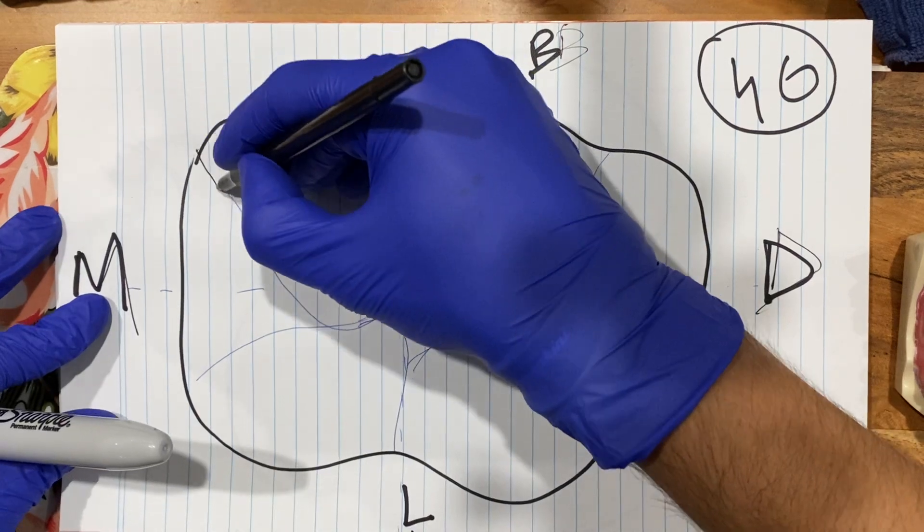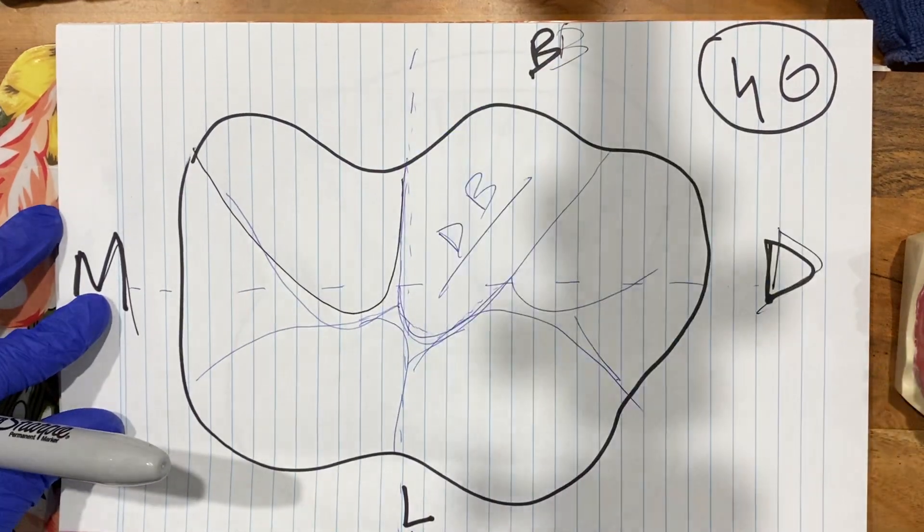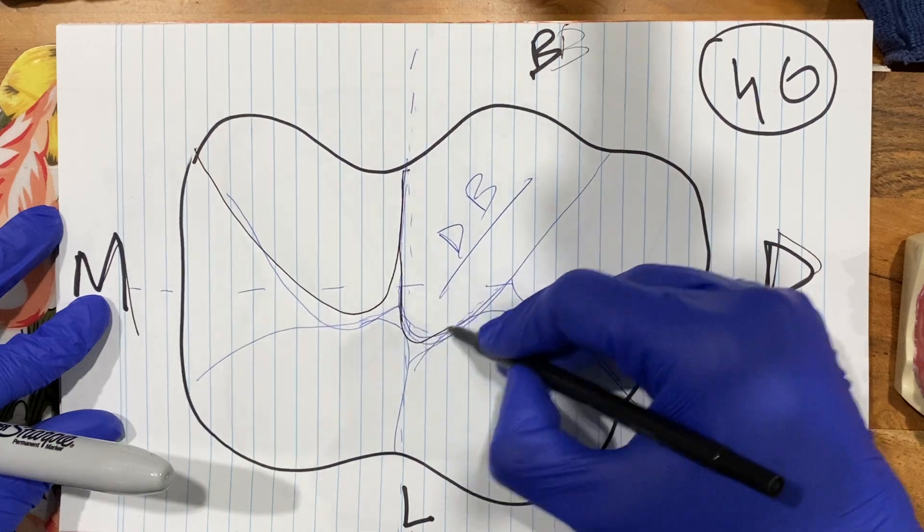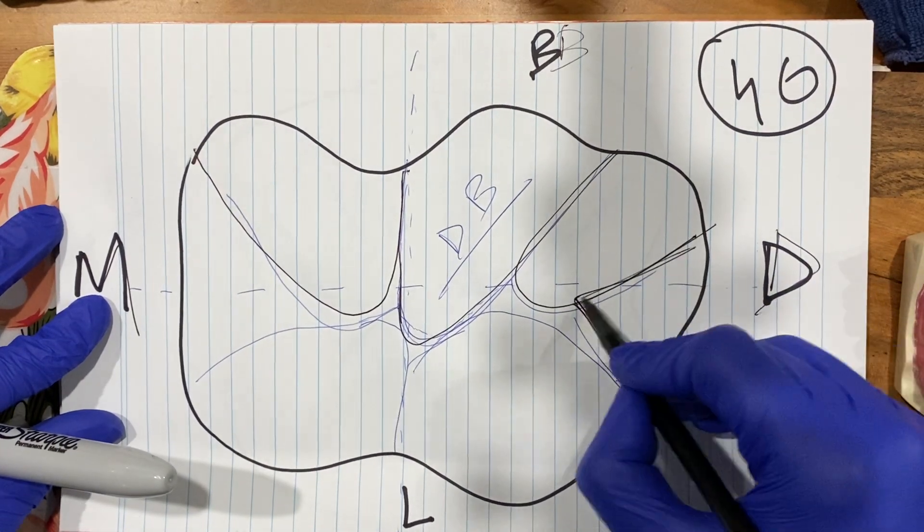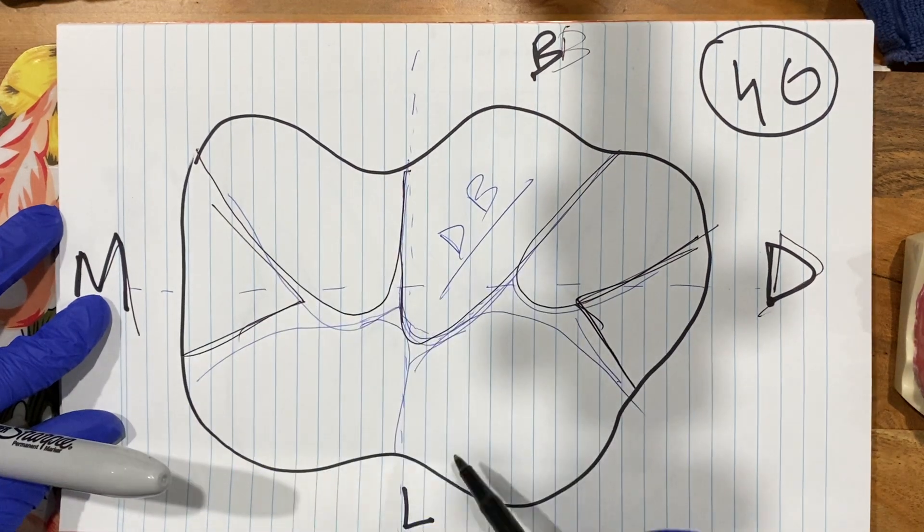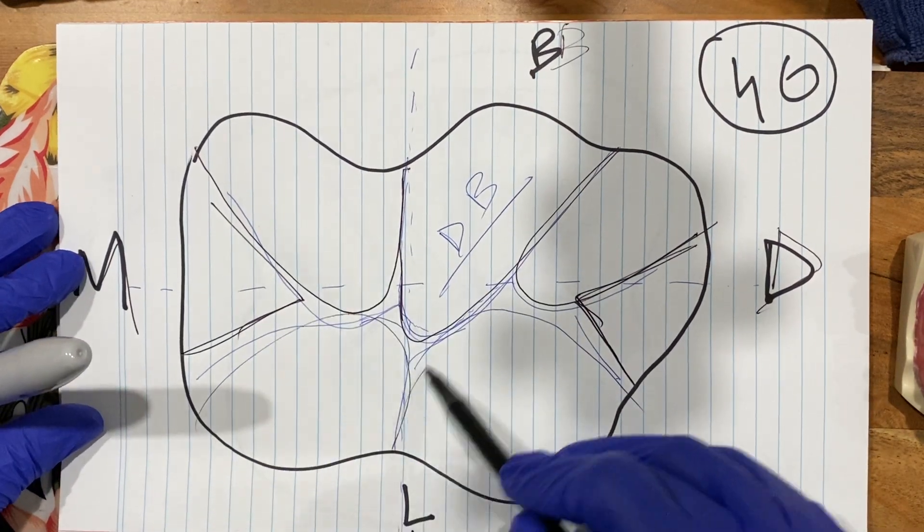So this is the mesial buccal, this is the distal buccal, this is the distal. This is the triangular fossa. Mesial lingual, distal lingual.